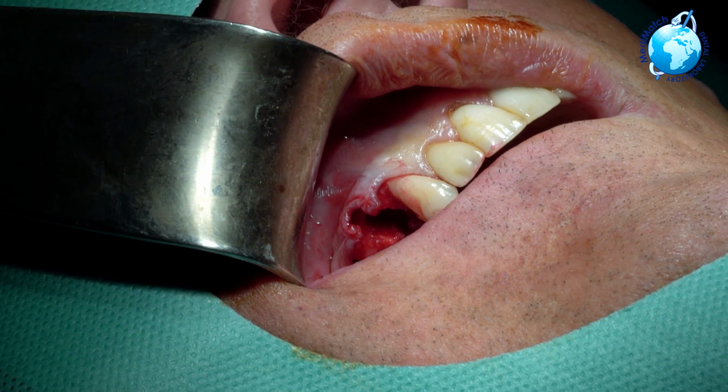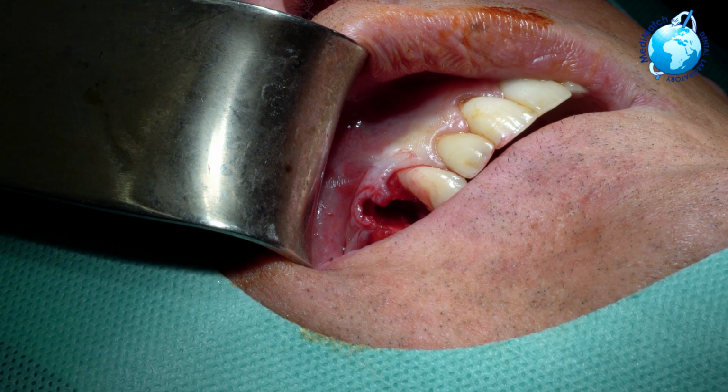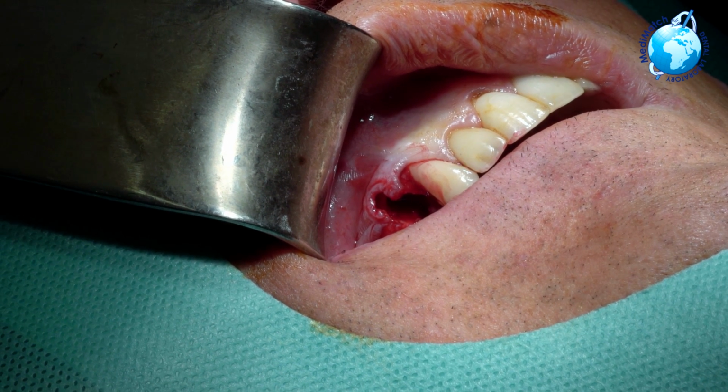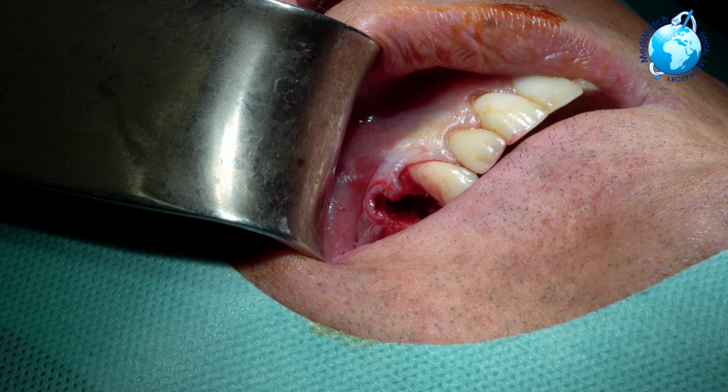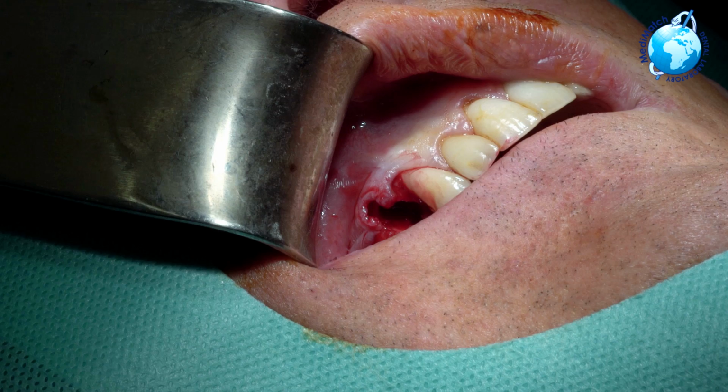Right. So what we need to do, I'll just triangulate this CT scan for a second. You can see the root is slightly mesially tilted on there, so we're quite safe to go a little bit distal of the socket. So this is how we're going to play this.